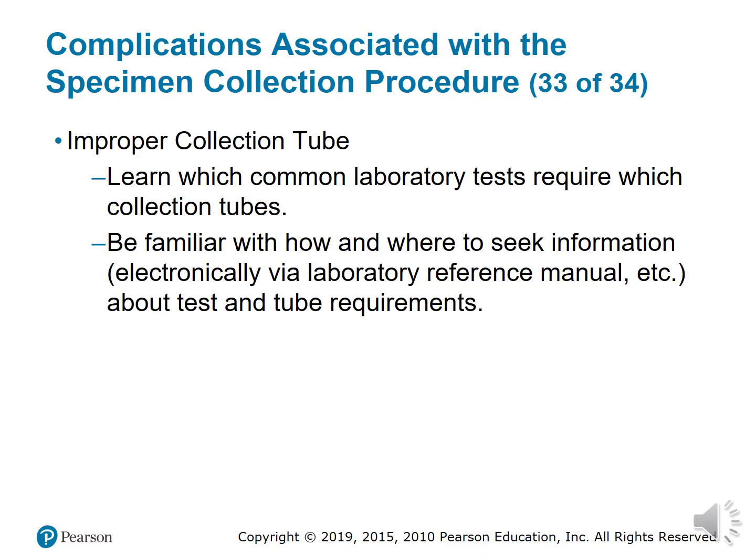Improper collection tubes is another cause of medical errors. The most common mistake that phlebotomists make is drawing an incorrect tube for a certain lab test. That's why we always look at our requisition and make sure we have all tubes that are needed. If in doubt, always look it up.